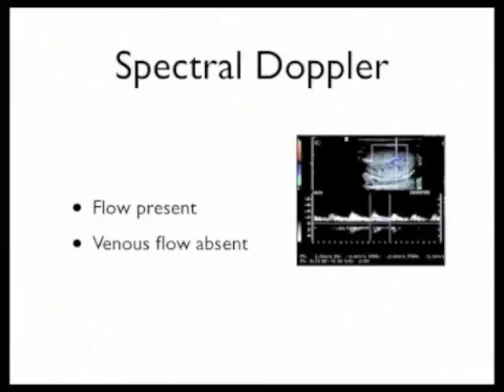So that's how you do it. We showed you this spectral Doppler thing. Let's talk really quickly about that. This is the more advanced part.